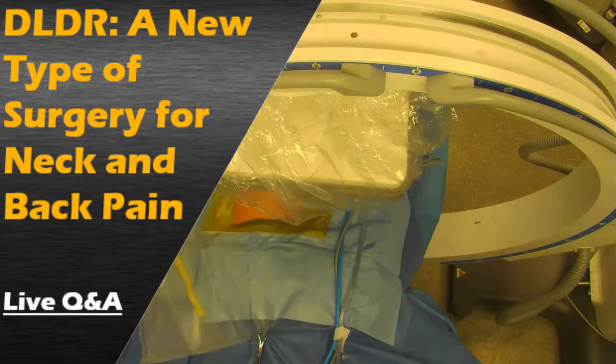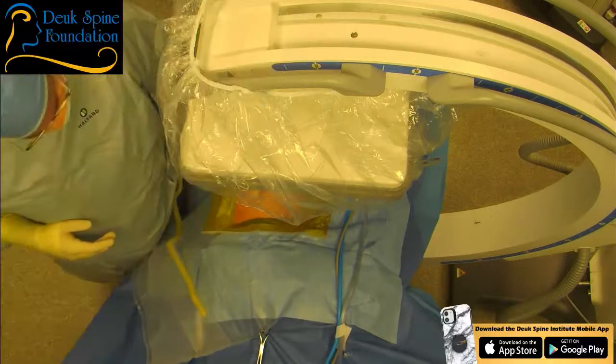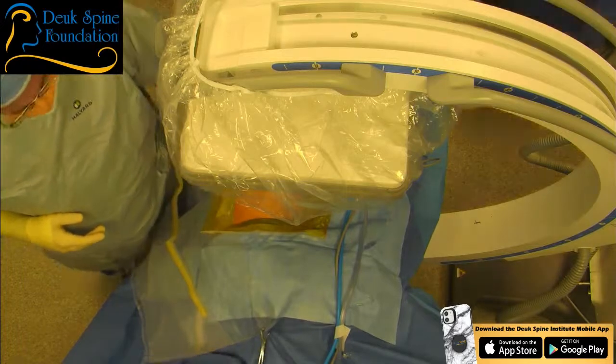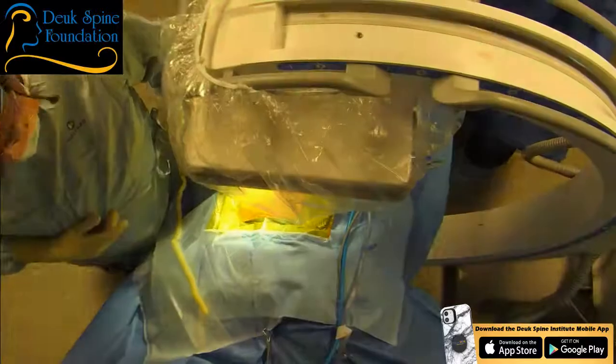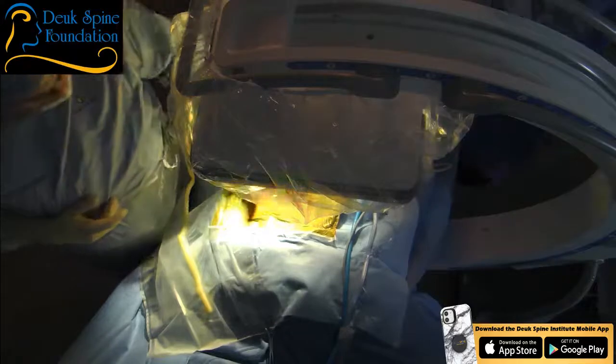Very good. All right, we're going to get started. Can you hear me? All right, Dr. Duke here. We're going to get started. I'm going to be giving you some numbing medicine, okay? All right, you just relax. If you feel any pain, say ouch, and I'll give you some more numbing medicine, okay?